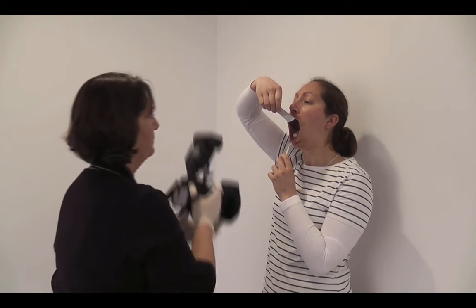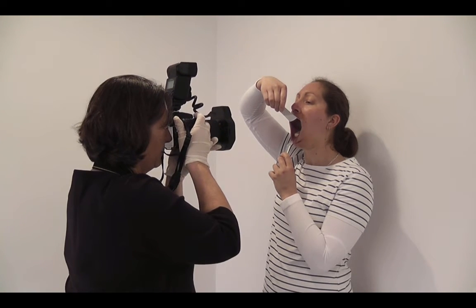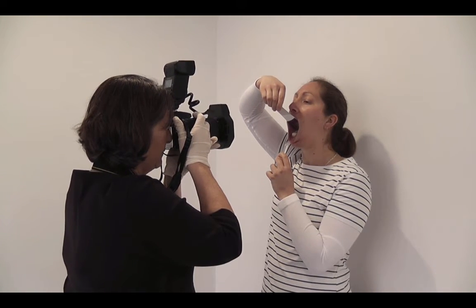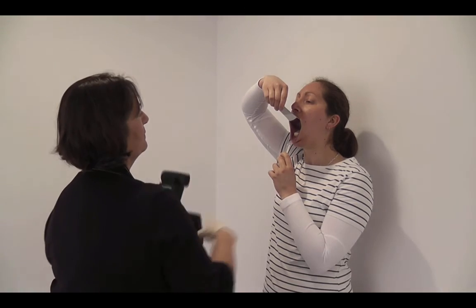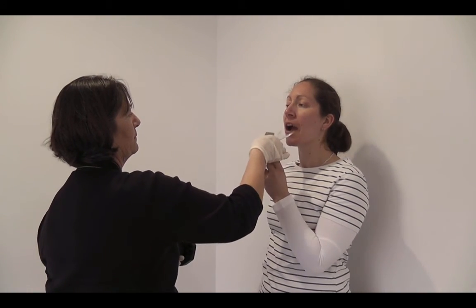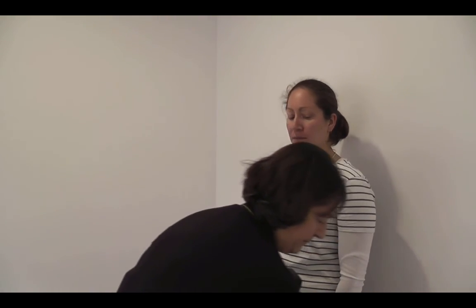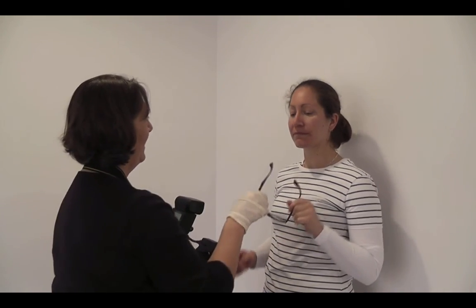At the end of this procedure, remember to clear your equipment away from the work area and decontaminate the area, including the camera and equipment, sterilising the retractors and mirrors. Finally, check and format the photographs as required, storing them in the computer and into the patient's file.